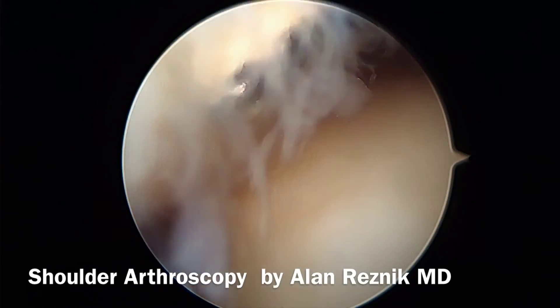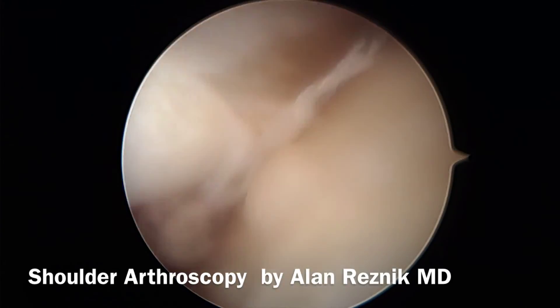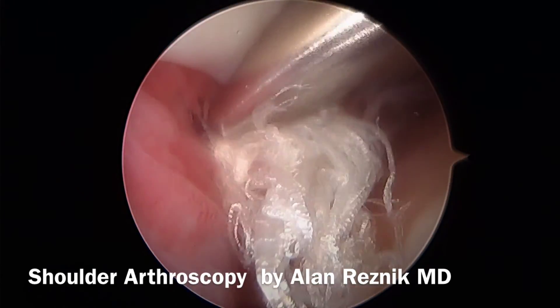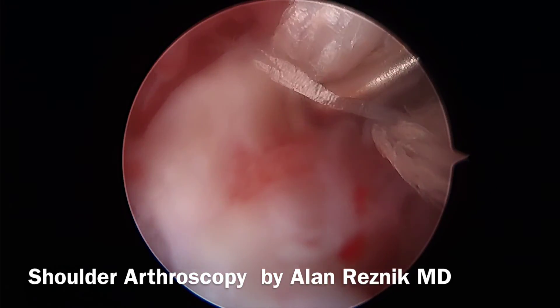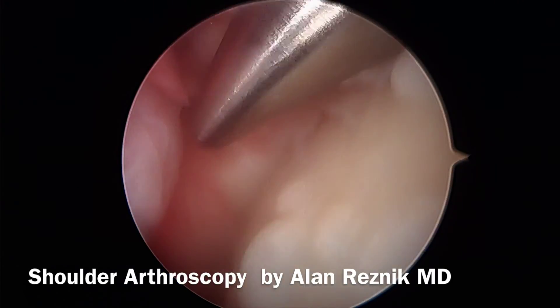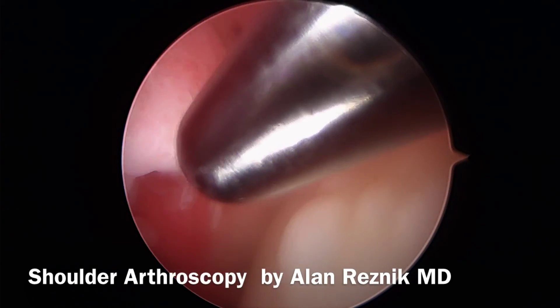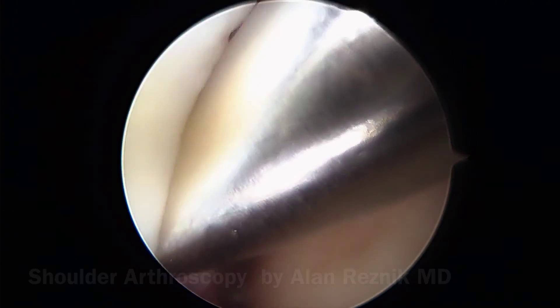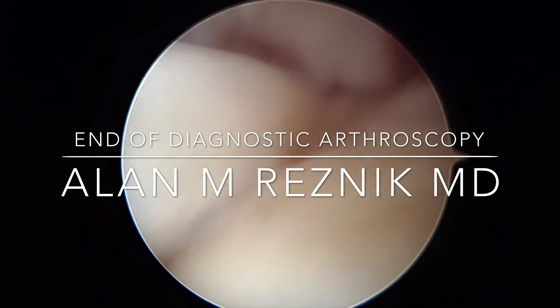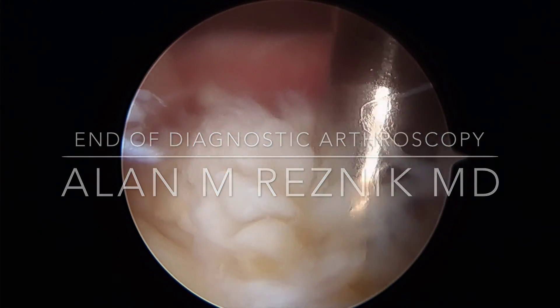We're seeing some fraying of the undersurface of the cuff. The biceps tendon itself is relatively intact — it looks good. We can mobilize it a little bit to see there's a little fraying of the edge there, and a little bit on the edge near the subscapularis, so there's a little partial injury to the biceps. Nothing terrible, and a little bit of partial tearing of the subscap there, but very small — not something I would go after in this patient. She's a little older and I don't think it's significant. Coming back here, we'll see the undersurface of the tear and the bony bed — this is where the fibers have come off the bone.